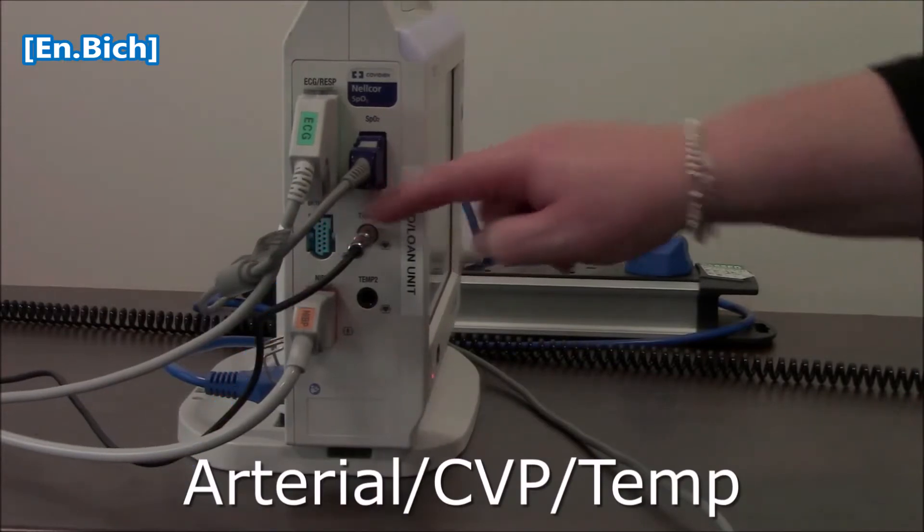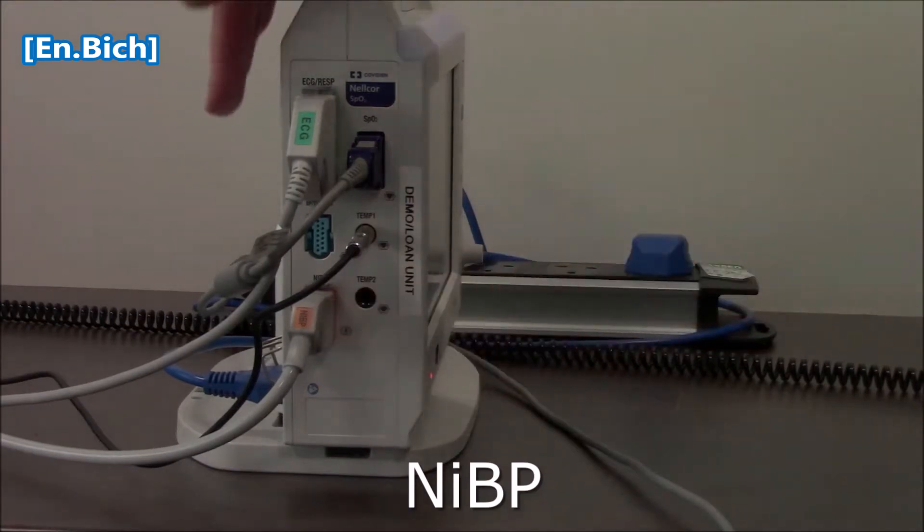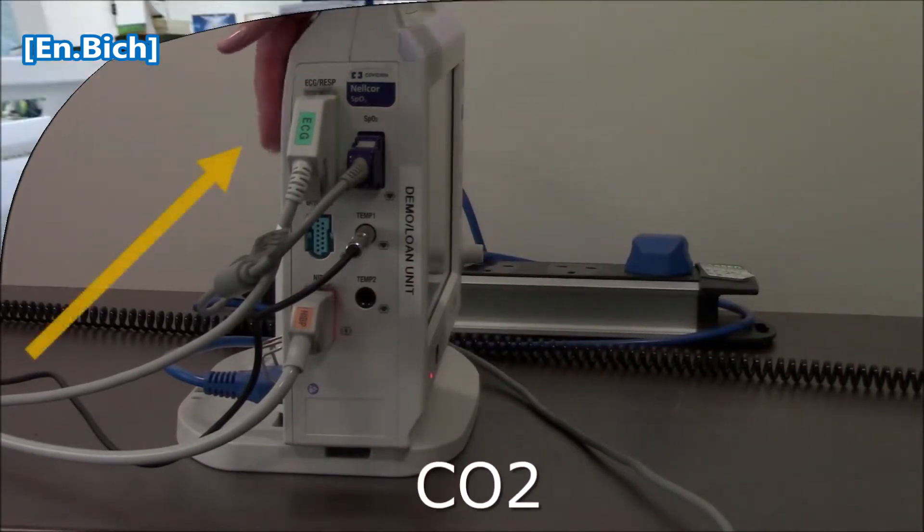Pressure monitoring, CVP, also temperature. This is also a temperature port, non-invasive blood pressure, and some of your monitors may have the CO2 module that will be here.